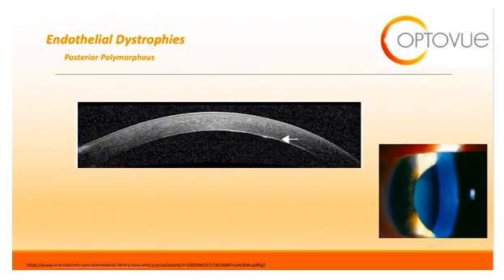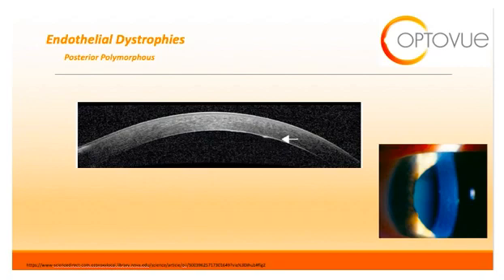The other common endothelial dystrophy is posterior polymorphous dystrophy, which appears as vesicles arranged in a linear or grouped fashion with a grayish haze and broad bands on the corneal endothelium. OCT will show a thickened hyper-reflective material on the corneal endothelium with extension into the anterior chamber.